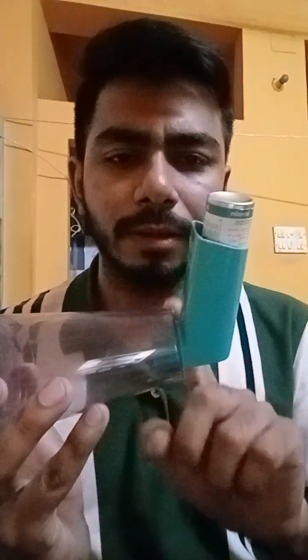And that's how we should be taking the inhalers, right? So once again I'm repeating the steps. First of all, you need to shake the inhaler well, then put it into the spacer, and then remove the cap of the mouthpiece of this spacer.